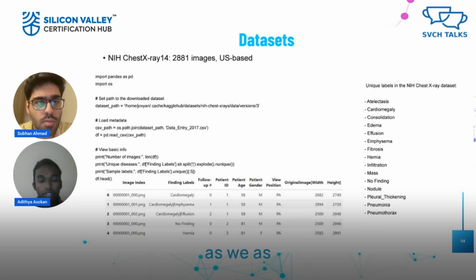As I told you before, this was the NIH dataset we used, which was US based. We wanted to see how different datasets perform with our machine learning model. So what we did was define the path first for the NIH dataset.